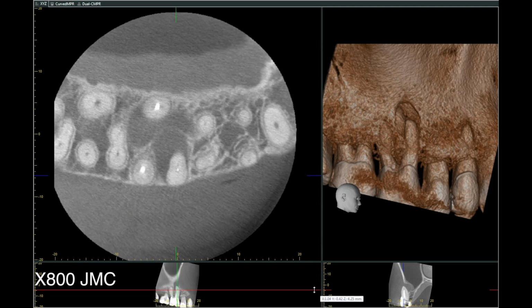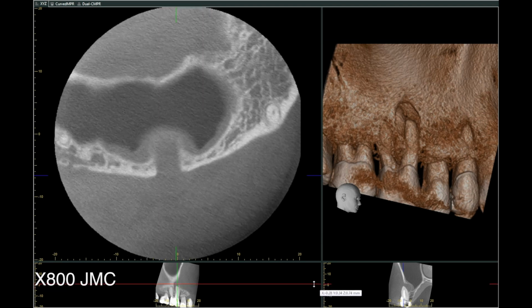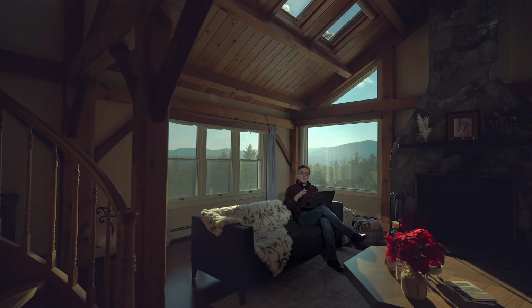So in cases like this, what I try to do is, instead of having to plan for a full revision of all the roots, including removal of the post and doing the palatal root, which I can tell you ahead of time is something that is recommended by many endodontists, I prefer to do selective retreatment of the affected tooth or the affected root, with the idea and the explanation to the patient that this is a conservative approach, so it may require further revision down the line by addition of the other canals.